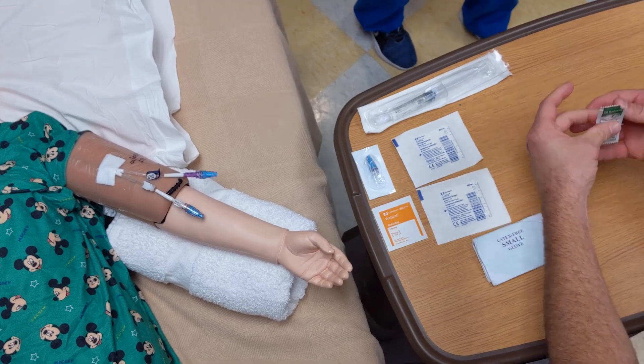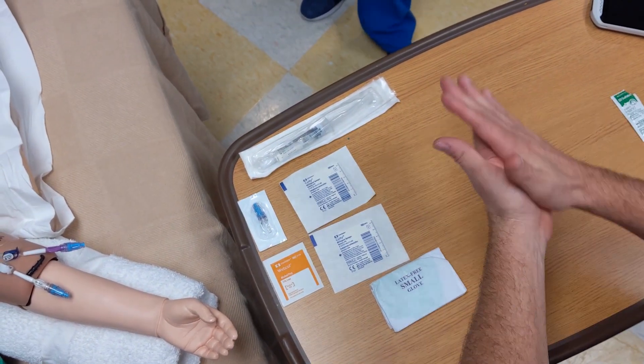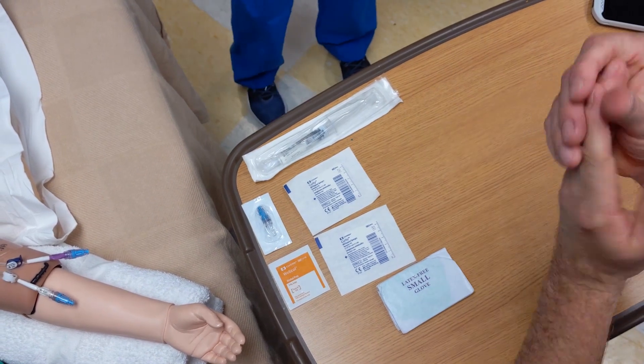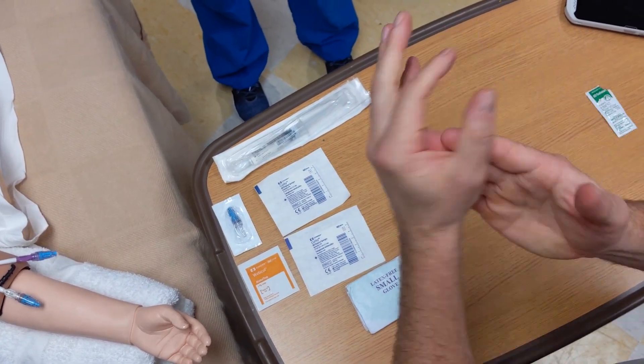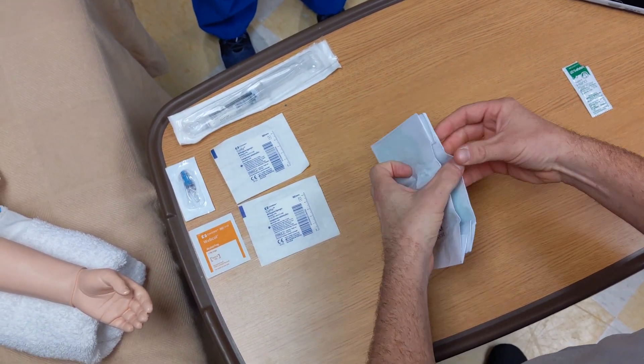After you don your mask, perform hand hygiene. After performing hand hygiene, don your sterile gloves.